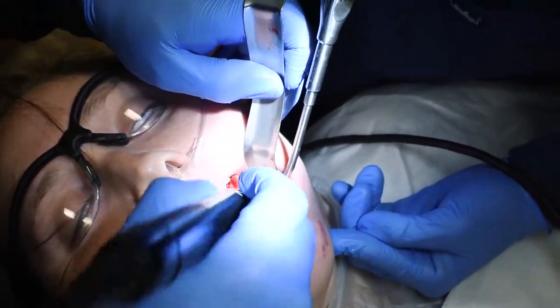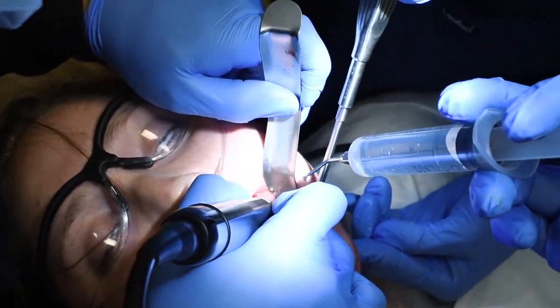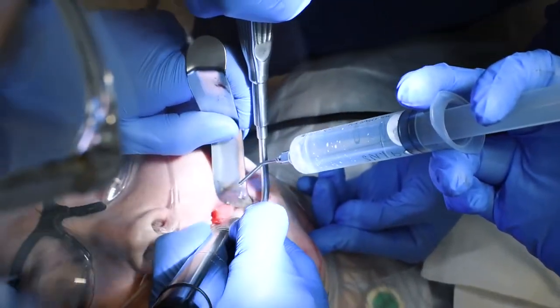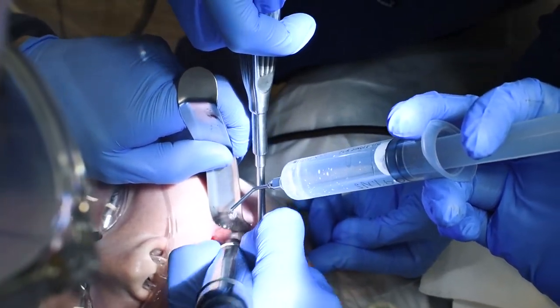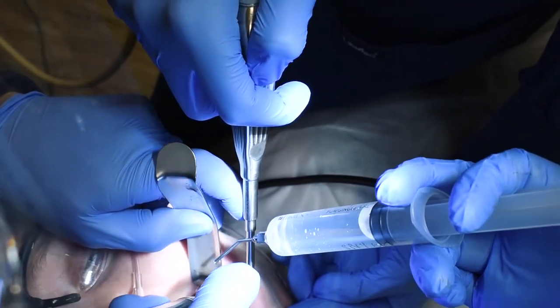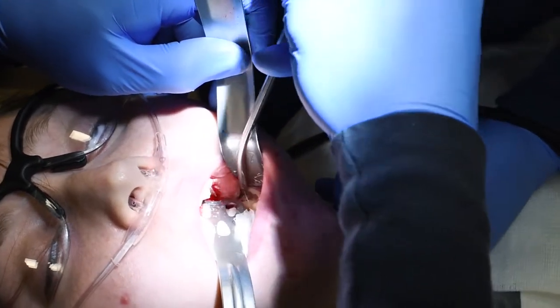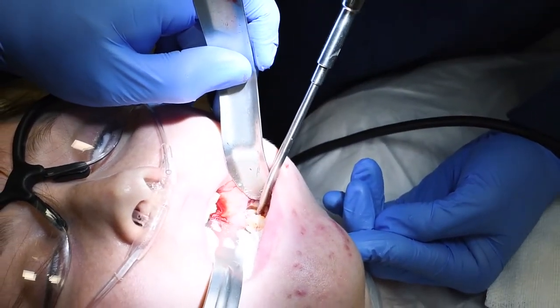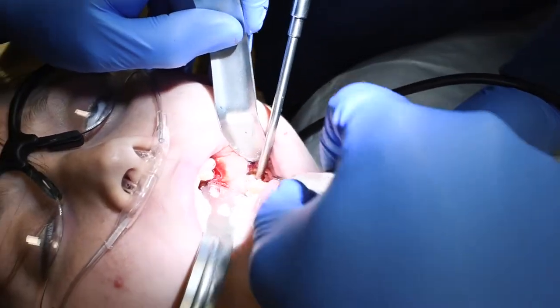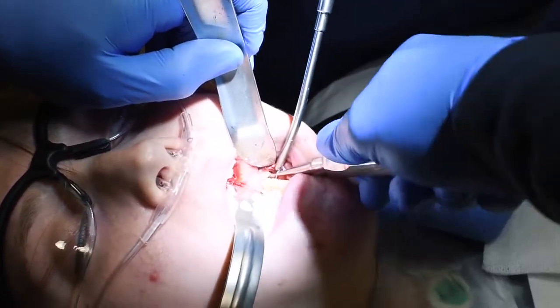Now we can get a feel for that tooth — it's sitting right there. I always like to correlate with a radiograph so I know where it is, and then we need to section the tooth. After I've made my buccal trough, I'm actually sectioning the tooth. Here's the buccal trough, there's the tooth section. I need a small straight elevator — now that the tooth is cut, I'm going to place my elevator in that groove, break it, and take out the back part of the tooth.